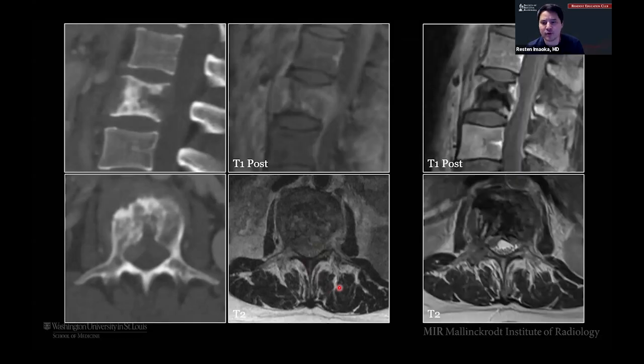This is what it looked like after we ablated here. So again, you can see this is the T1 sag post. You can see there's a little bit more space here between the tumor and the nerves compared to this one over here. And then here on the T2, you can see now some of that stuff has retracted. We actually do see some CSF now within all these nerve roots.